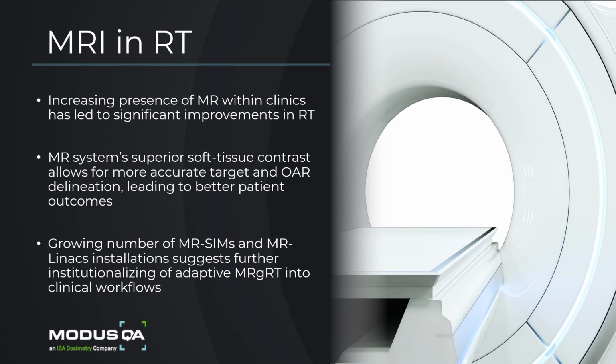Over the past few decades, the installation and use of MRI has become increasingly prevalent within clinics. Taking advantage of its superior soft tissue contrast and lack of ionizing radiation, MRI has been increasingly incorporated into numerous steps of the radiation therapy planning and delivery workflow, where it is slowly becoming a standard of care for IGRT. This is in part due to physicists now being able to more accurately delineate targets and organs at risk, thereby allowing you to escalate doses while still minimizing treatment-related toxicities, leading to, of course, better patient outcomes.